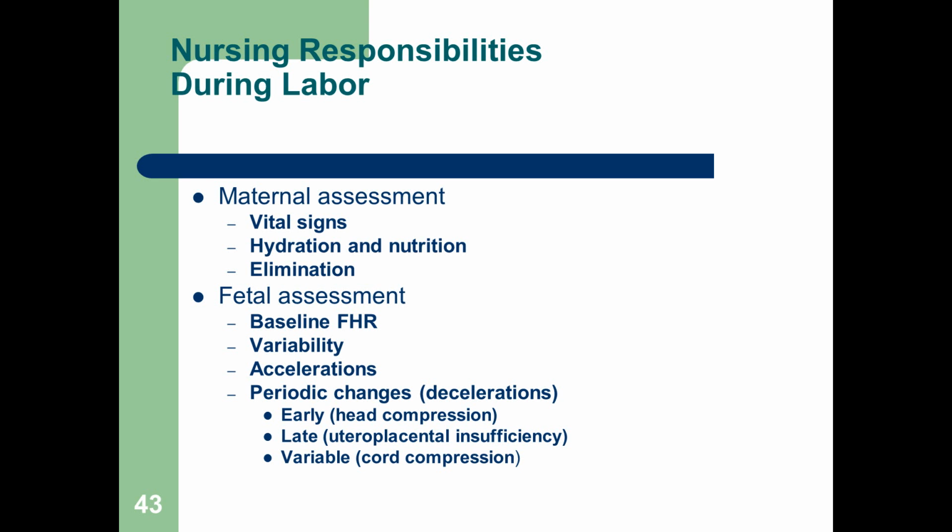Fetal assessment, you're going to obtain a baseline fetal heart rate. You're going to monitor for variability, for accelerations, and any kind of periodic changes with regards to decelerations, okay? And we talked about VEAL CHOP. Make sure you have that in your notes because you will see that again, okay?